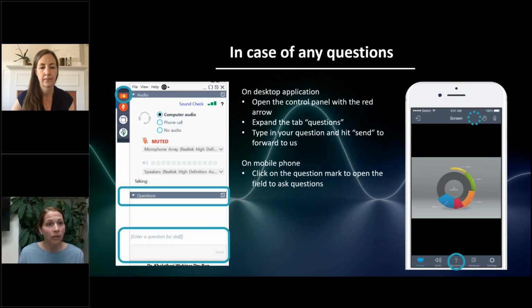Thank you. What would happen if you didn't dark adapt at all? So if you didn't dark adapt at all, the advantage of dark adapting is to bring out the rod response. So you get a less robust transient response for the pupillometry.